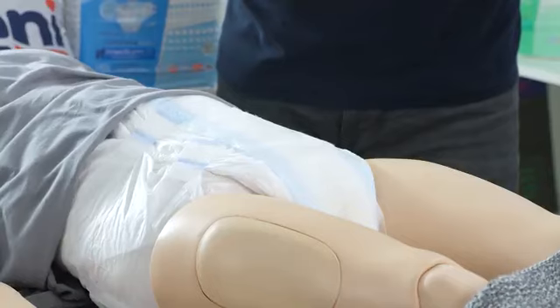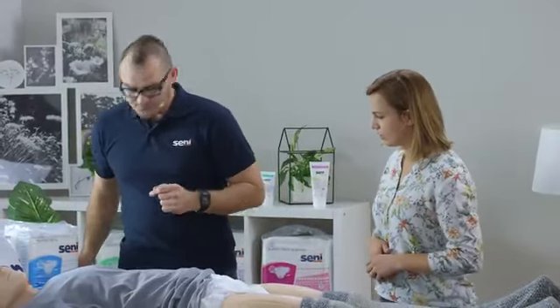Good. What else? First and foremost, we want the product not to leak, so it must be well fitted to the body, just like my pants. It has to adhere properly, because if it is too large and does not adhere, there may be leaks from the back or the front.